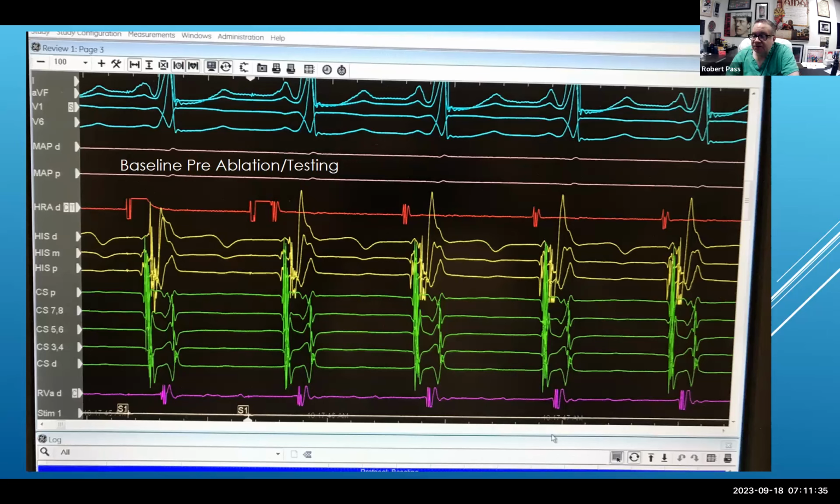The specific way in which the signals are displayed is specific to the individual electrophysiologist. They are not standard. And so, for example, if you're ever taking your board exam and you're asked to interpret an intracardiac electrogram, it is not likely to be displayed in precisely the order that I have displayed it here on this page, nor are the colors going to be the same. It happens that Barry and I used exactly the same colors because, as I often joke, we are all victims of our training, and these are the colors that were used when we were trained in electrophysiology in Boston.